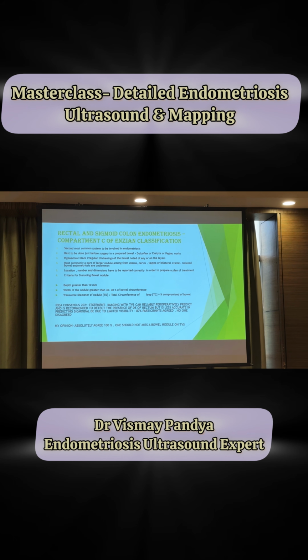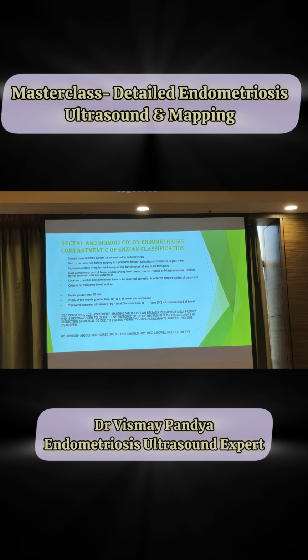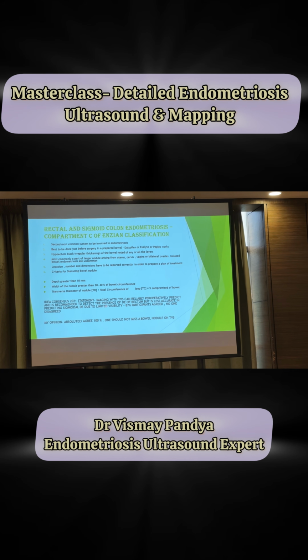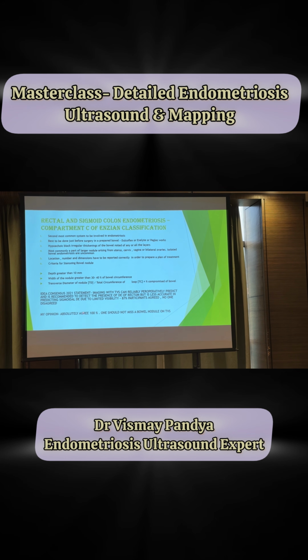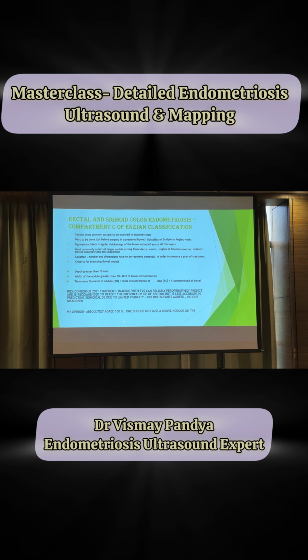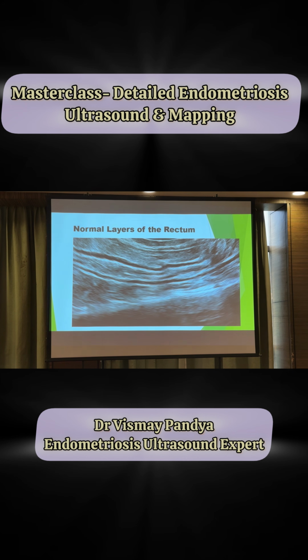So you will be confused what to do then. Then this will give you a better idea. IDEA also agrees on it, and it has said it is recommended to detect the presence in the rectum. Less accurate for, of course, sigmoidal. Sigmoidal is something which is very difficult. And my opinion is absolutely you should be able to diagnose rectal endometriosis on transvaginal sonography. One should not miss a bowel nodule on TVS. Anything can be missed, but a bowel nodule should not be missed.